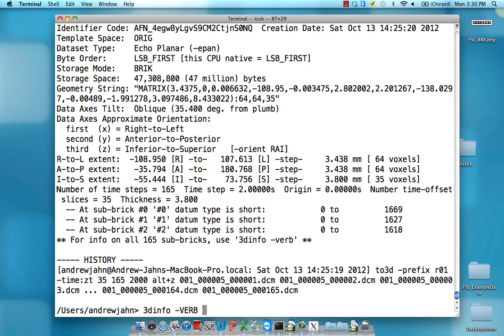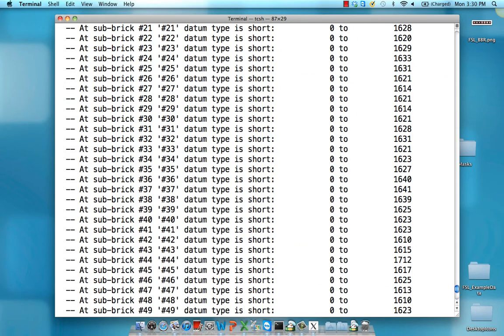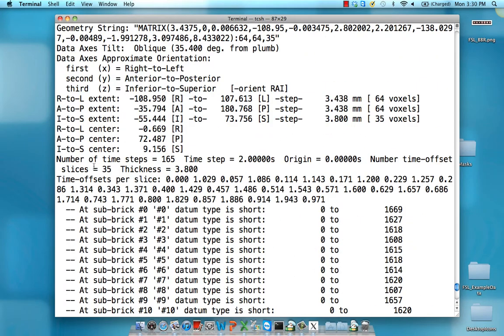You can produce more information by using the all caps verb command. In this case, you might want to know information about the time offset between the slices if you're doing something like slice timing correction. This also gives you information about whether the slices, the acquisition is interleaved or sequential, and whether it's ascending or descending.